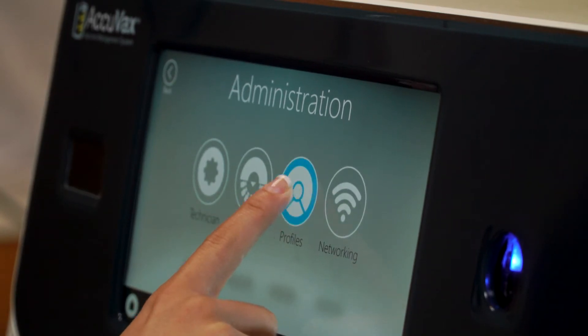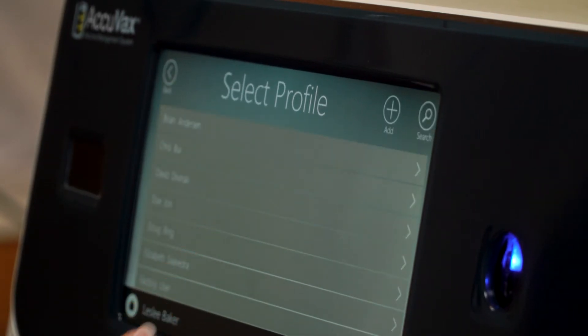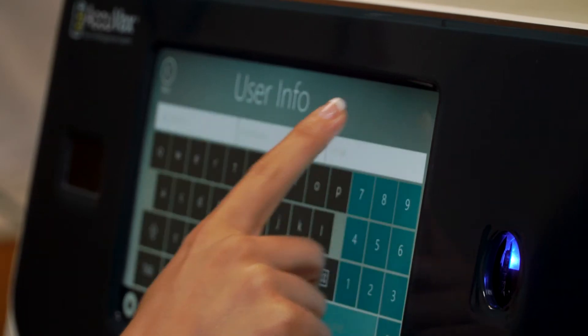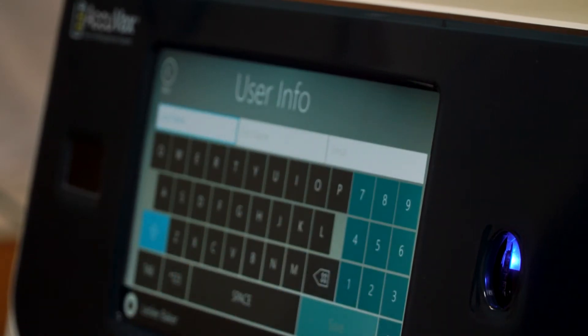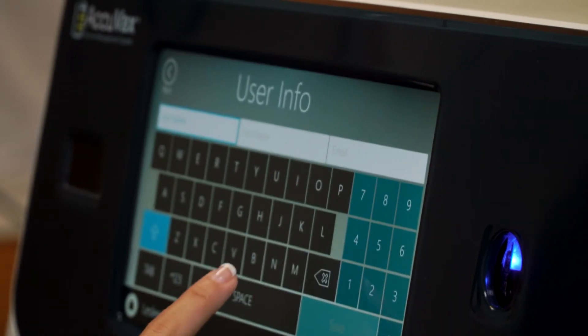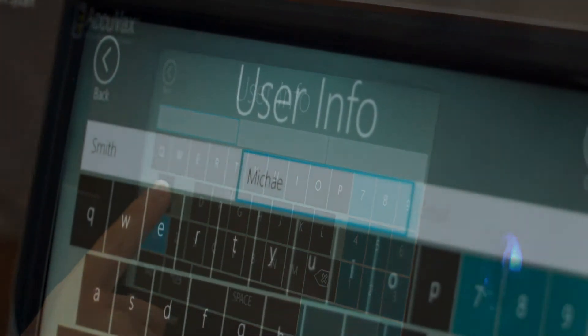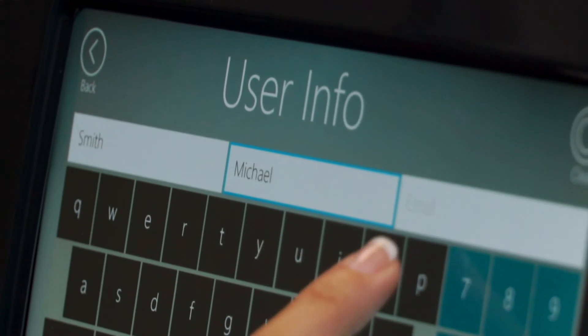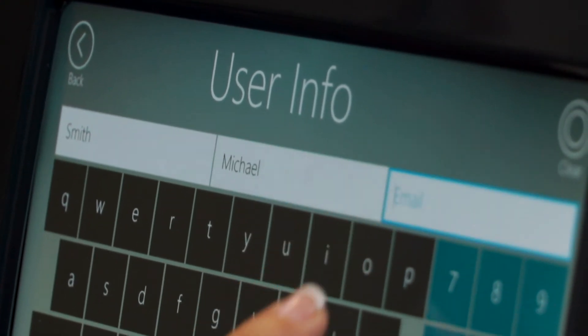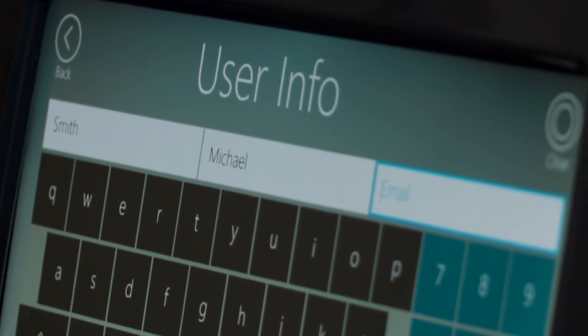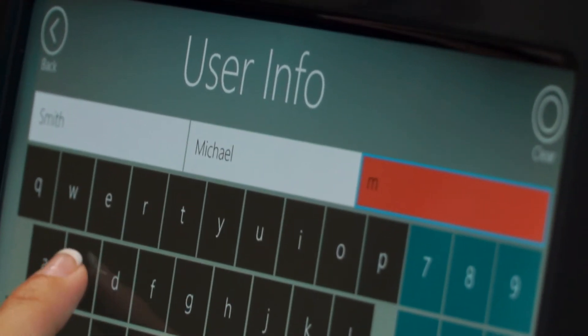First, select Profiles. Next, select the add icon at the top of the screen. Once on the user info screen, enter the user's first name, last name, and email address.